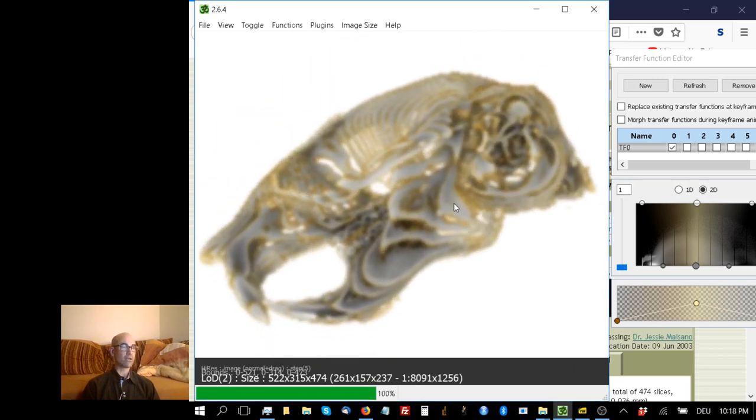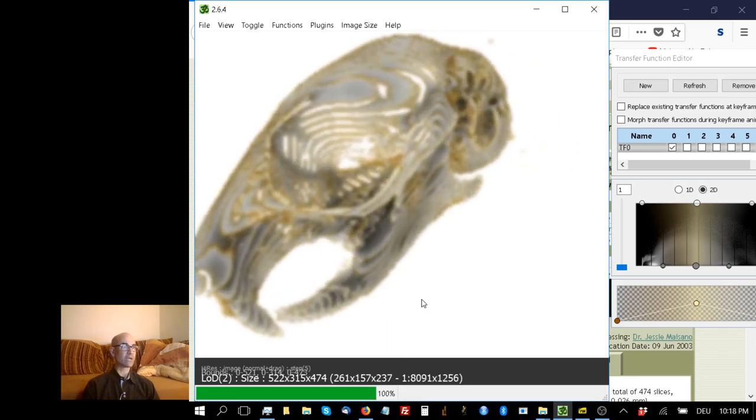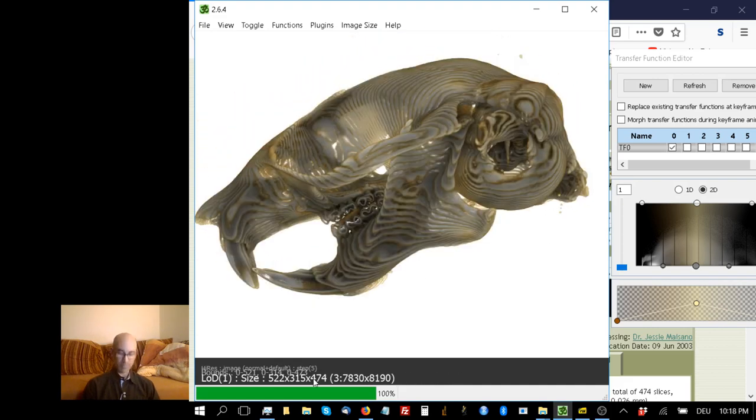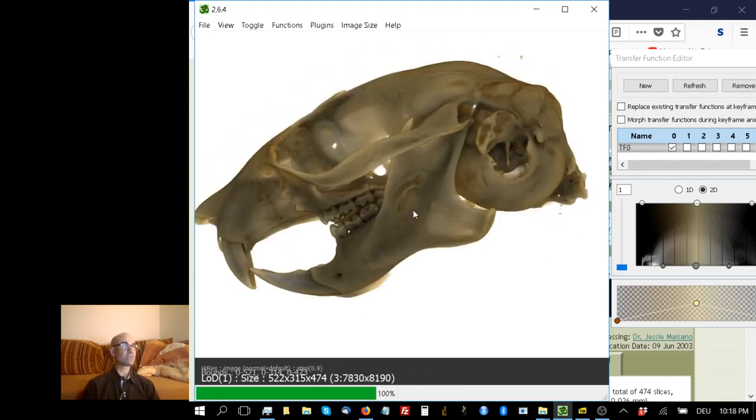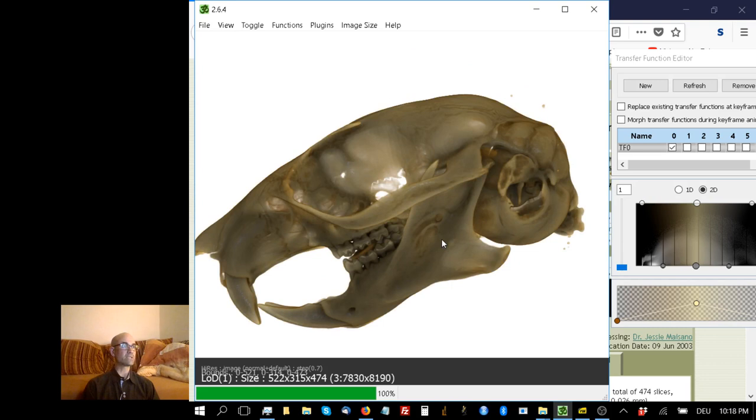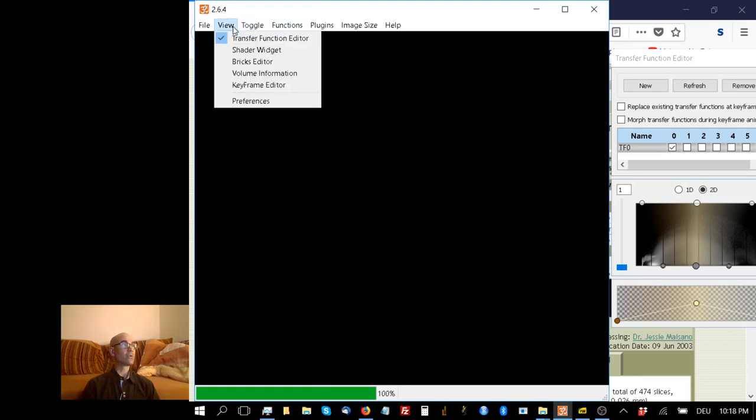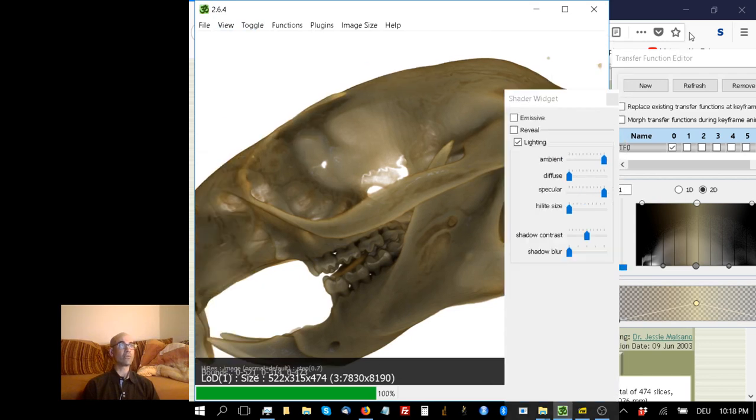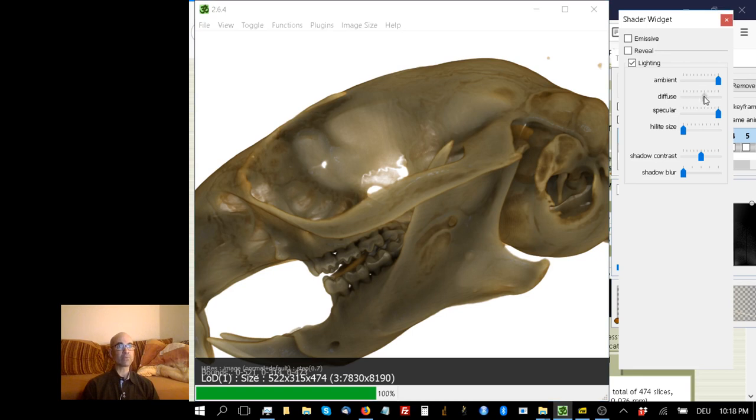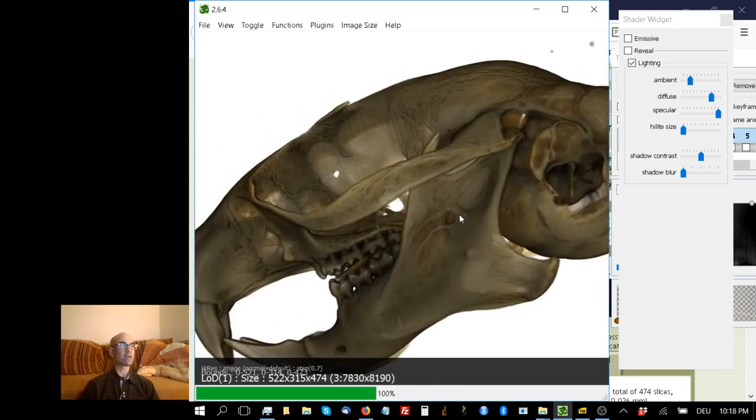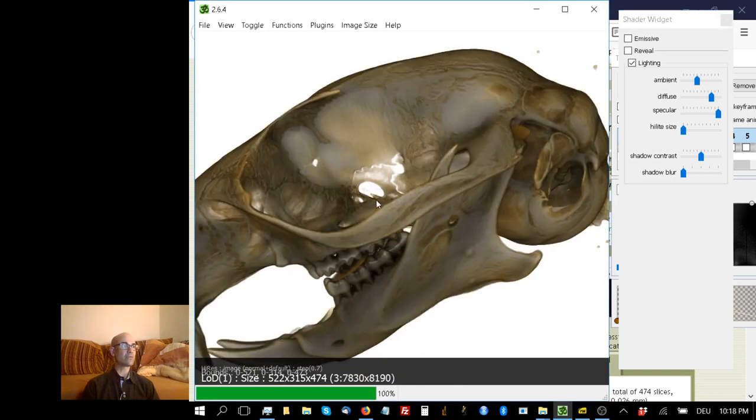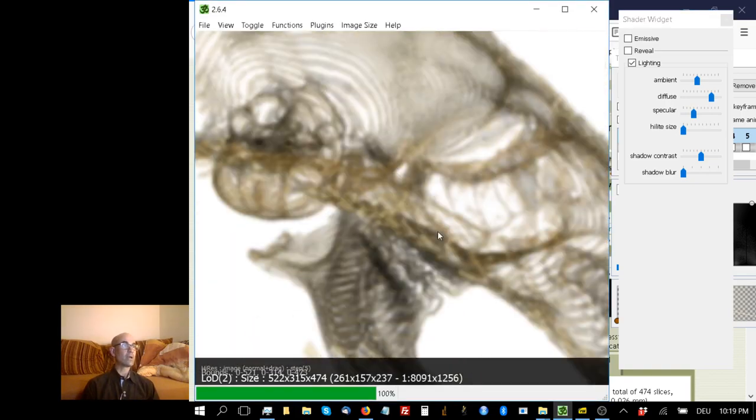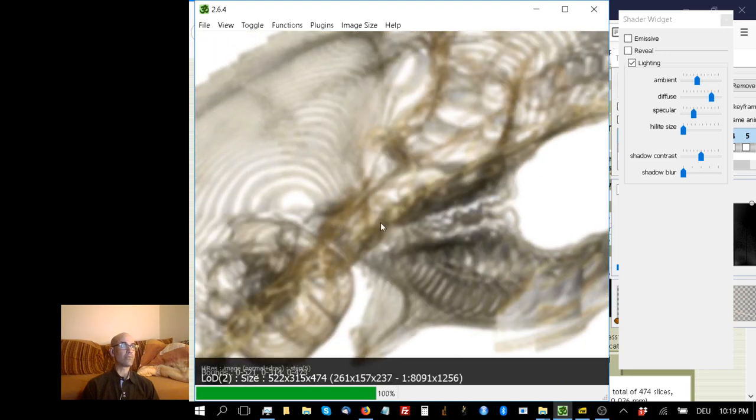I was telling you about this step size. That's a pretty nasty looking volumetric rendering. I want to hit page up and now the step size decreases and the quality goes up, but it becomes less responsive. I'm down to 0.7. This is a pretty small CT scan, so I'll use the mouse wheel to zoom in. I want to show you this shader widget. I can bring this outside of the window to give myself more space. Personally, I think it looks better with a high diffuse value and a low ambient value. The contrast comes out better. I'm also not a huge fan of these specular regions.